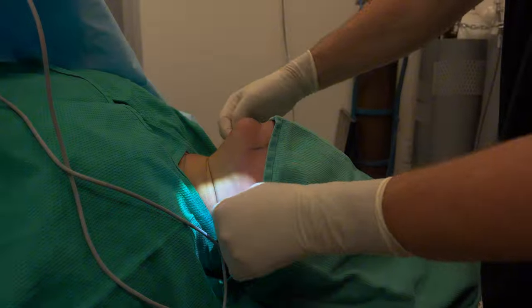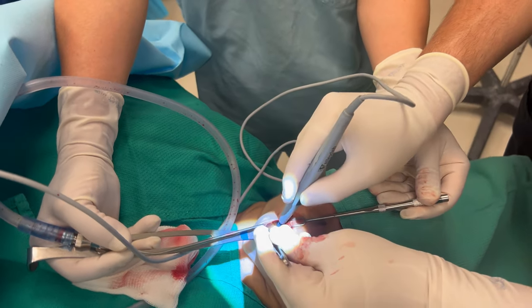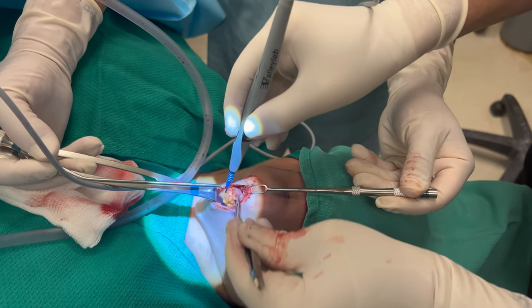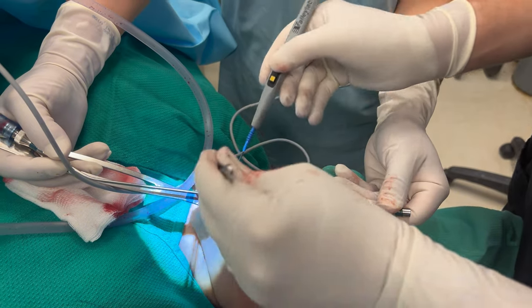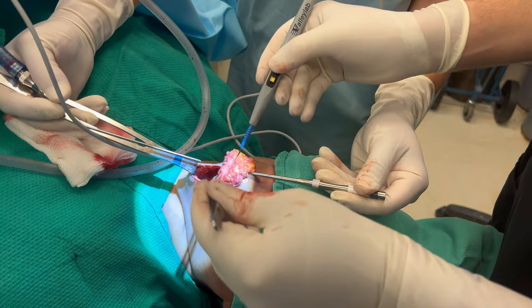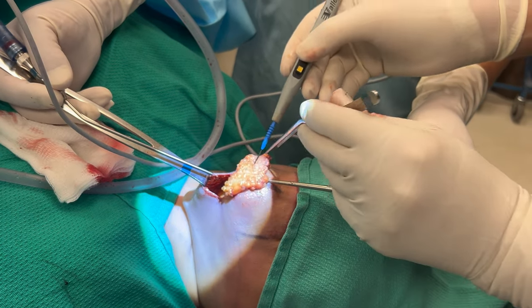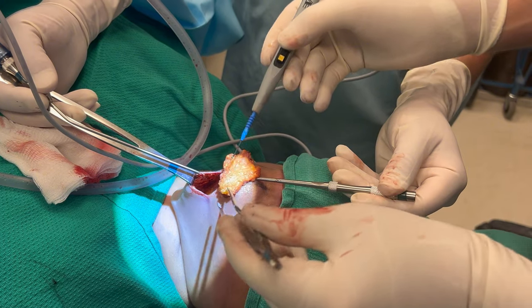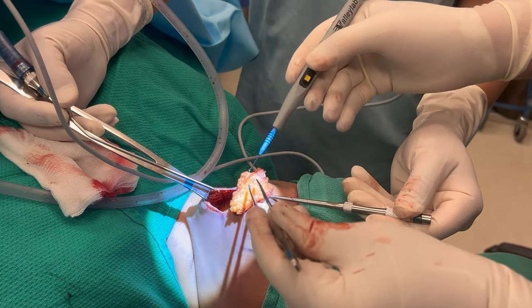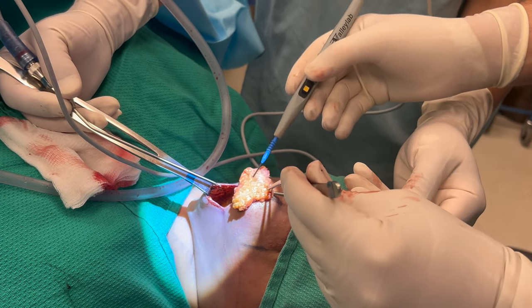This is really just midline neck work — minimal scar, no big scars on the sides. After the liposuction, we open the neck and go in deeply. I'm going to take a little chunk of fat from the midline — this is something that could not have been liposuctioned. This is a very dense, deep fat, so the only way to remove it is through direct excision — cutting it out. This is where the deep component comes in: a small but significant chunk of fat.